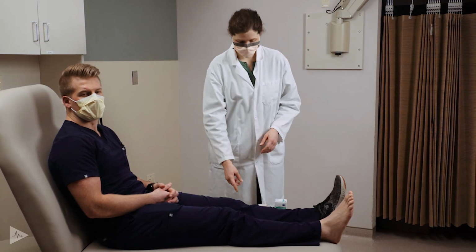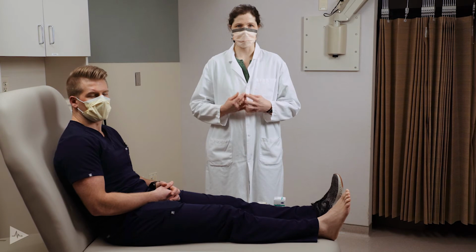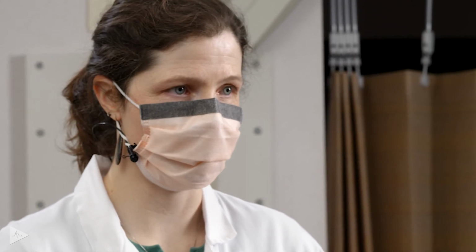When using wraps, we may be getting insufficient overlap, and with excess swelling that can cause bulging or breakthrough of tissue and cause blistering and damage to the skin. Wraps will shift over time, especially depending on the patient's activity, and so they may need to be rewrapped throughout the day, which also can be difficult for patient compliance. With compression stockings, the main difficulty can be having enough oomph to get a high compression stocking over the foot and up the leg. And there are multiple different types of devices available for assistance.